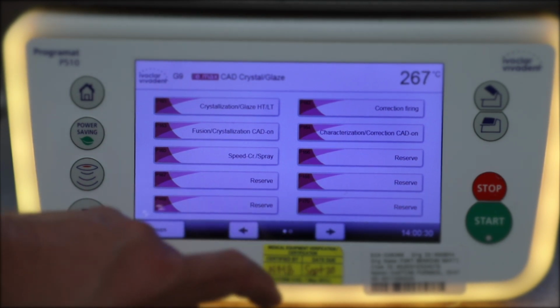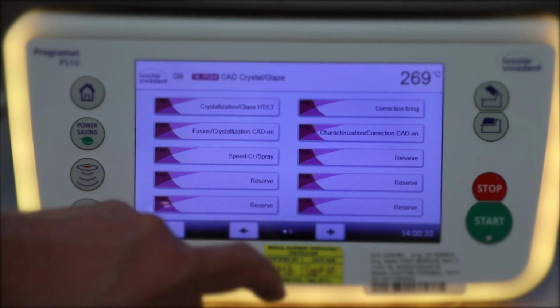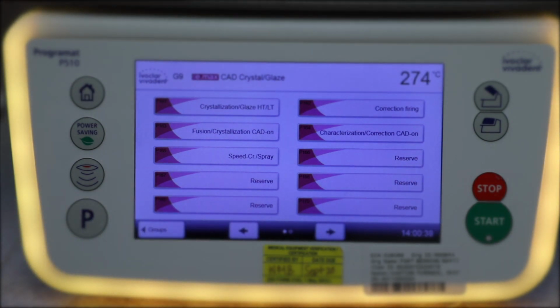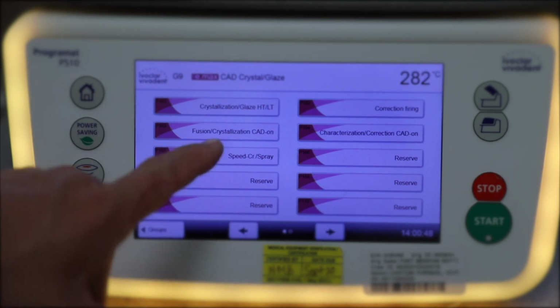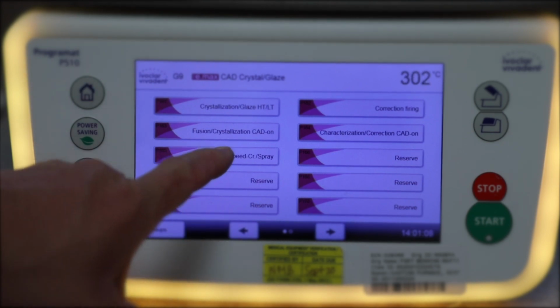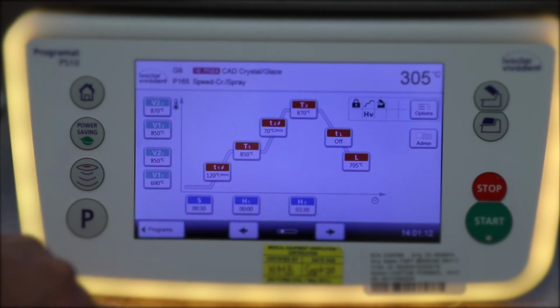If I was going to do a separate firing and glaze this only after I've crystallized it, I would do a correction firing. And so I'm going to do this crown for this shade guide in 2 steps. First step is going to be crystallizing it, and second step is going to be the glaze firing. So for the first step here, I'm going to go ahead and do a Speed Fire. You may think, okay, well, you have some stain that you put on the back of that, is that okay? Well, I use such a small amount of stain, and really I'm just using it as a label. That's all that is, just labeling the crown. It will be okay. I've done this on the other ones. It's set up fine, had no issues. So we're going to do a Speed Fire here, and we're ready to go.